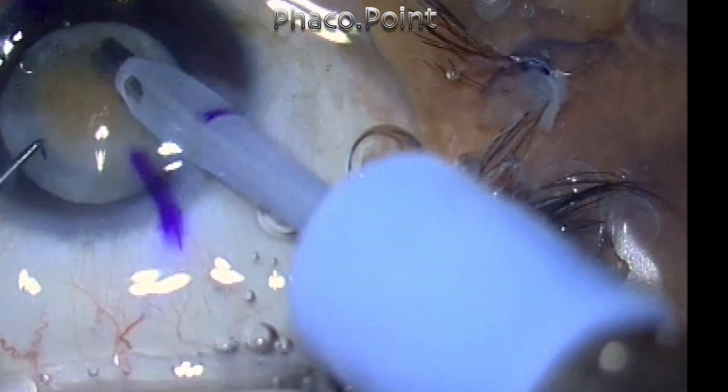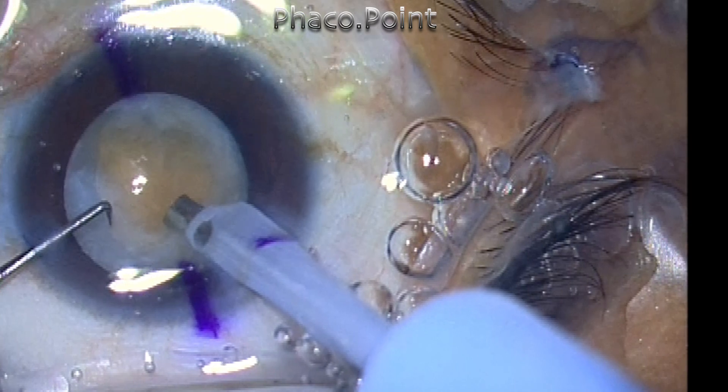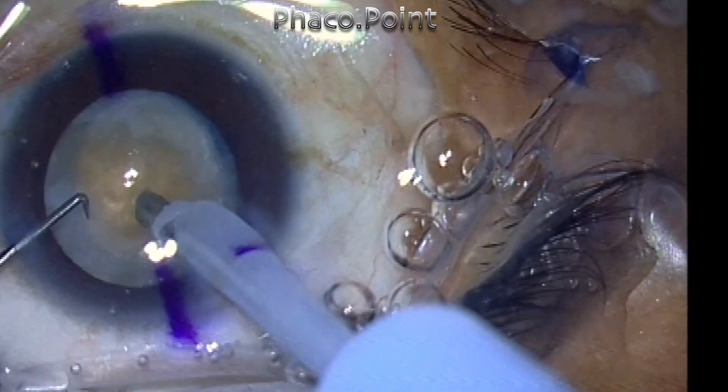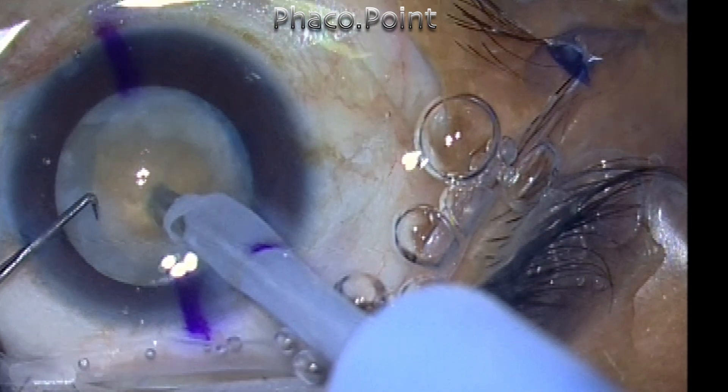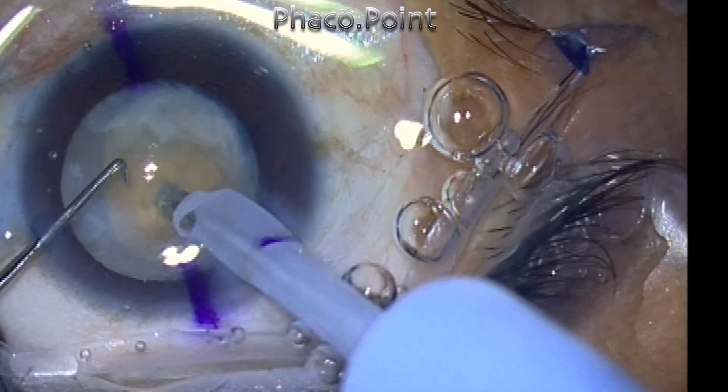You have to use sufficiently high power. I'm using a power of 50% and I'm using a vacuum of 350. You have to take your time to bury the 1.5mm exposed phaco tip into the heart and substance of the nucleus.